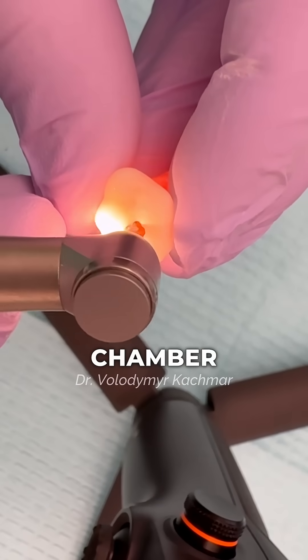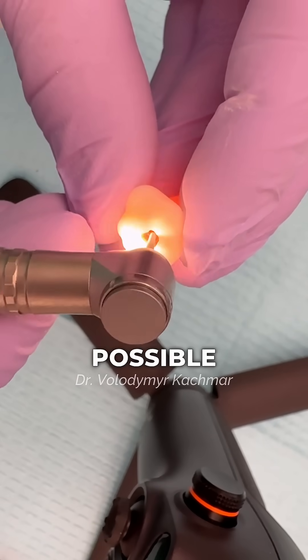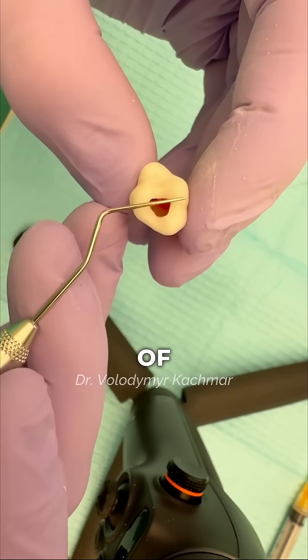Second, clean the pulp chamber. You can use either an excavator or a round bur. Try to be as conservative as possible to avoid unnecessary removal of dental tissue.